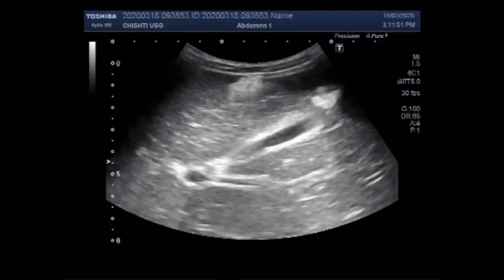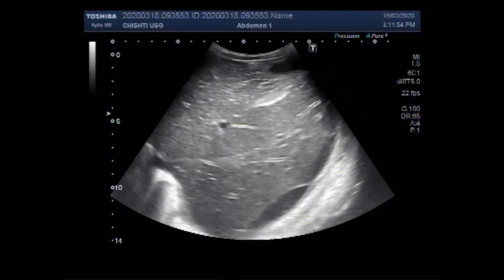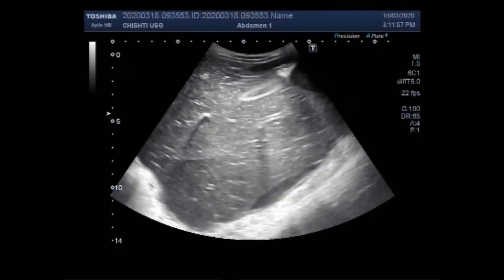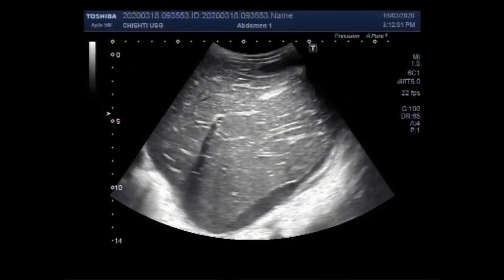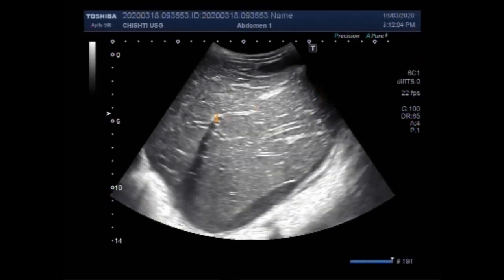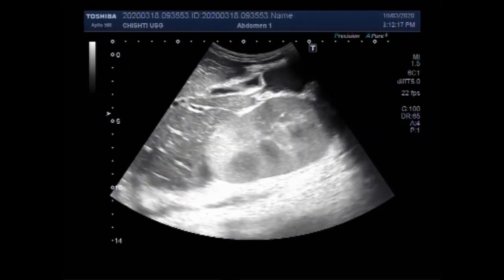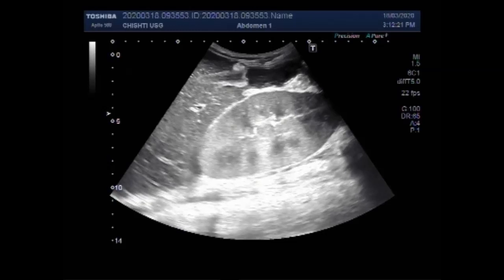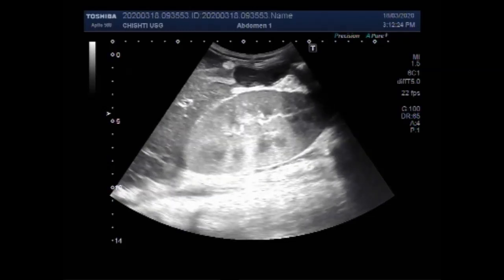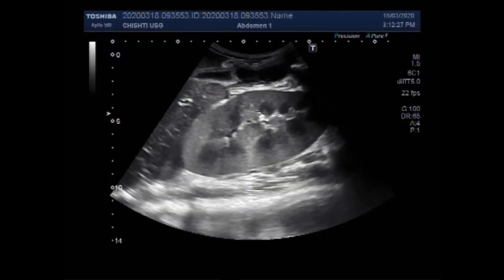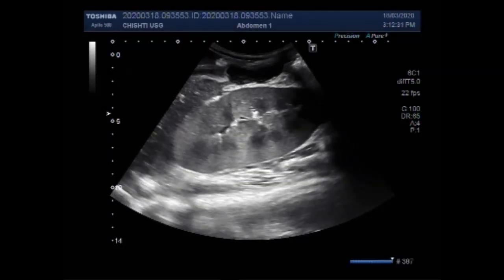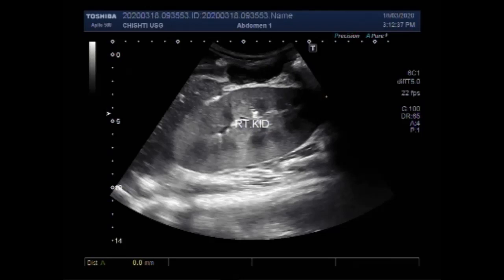This ultrasound video shows scanning of a female patient aged about 11 years, showing one kidney shrunken and the other showing compensatory hypertrophy. You can see the liver. Incidentally, this patient was also suffering from intestinal obstruction. You can see the liver, gallbladder, and the right kidney. Considering the age of the patient, the size of this kidney is enlarged, showing compensatory hypertrophy.